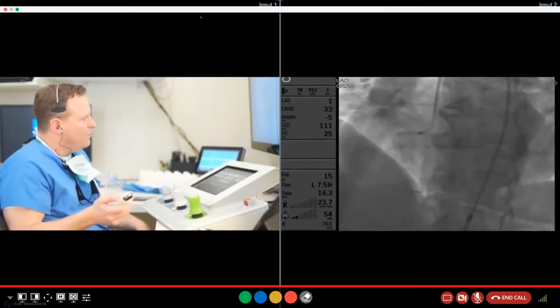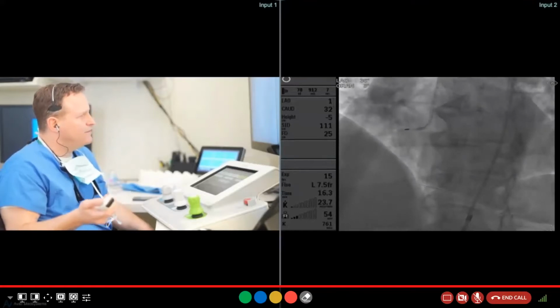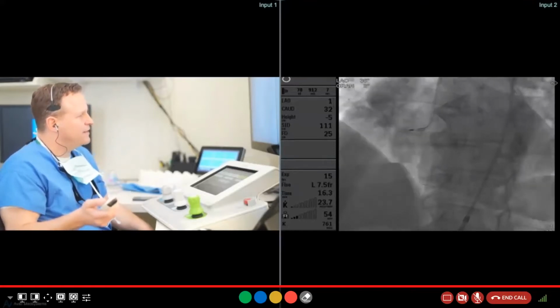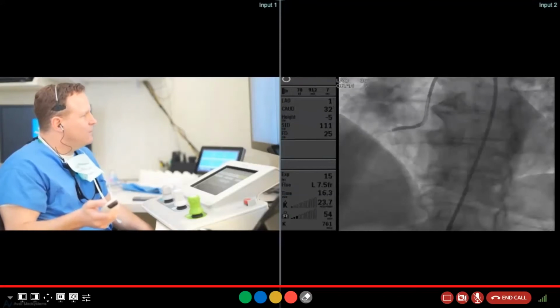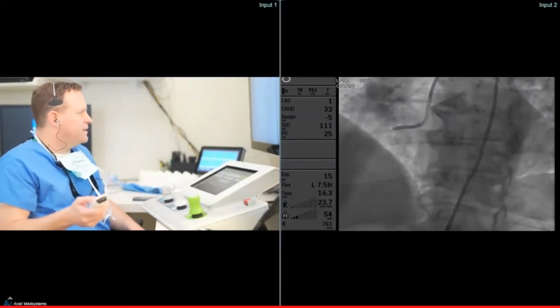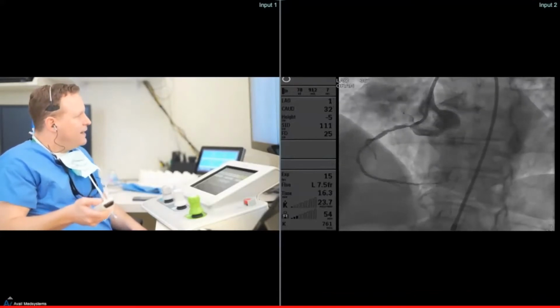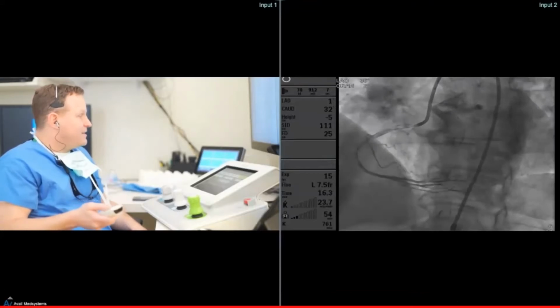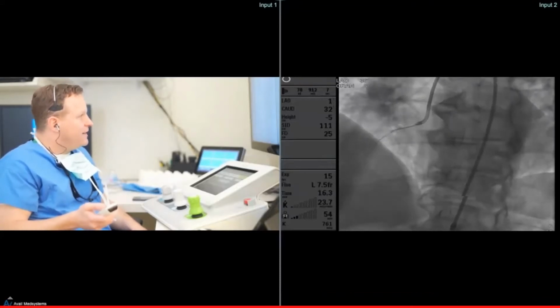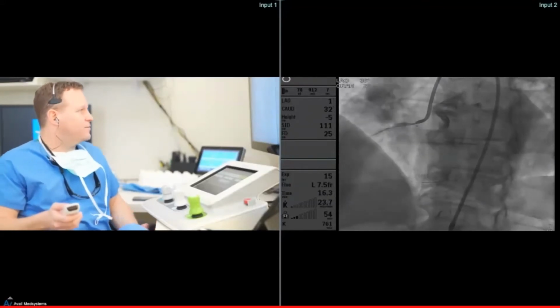I wired it, went down with a microcatheter, and traded out for a RotaWire. You can see here, we just did a 1.5 burr rotational atherectomy. For the sake of time, I won't show it. We ballooned it to get flow, and then I did optical coherence tomography, an OCT, which I've become more and more of a fan of. And you can see we had a nice dissection and got good expansion there. And then from there, we went ahead and treated this based on OCT measurements. We used a 3.0 by 28 millimeter drug-eluting stent.